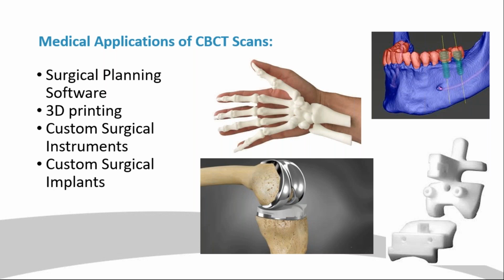And last but not least, the picture here of the knee replacement. We're hoping, and this is future applications, but we're working towards this now, is looking at actually being able to template for custom surgical implants and having that happen. We're currently doing that at Curvebeam in ankle replacement, but just steps that we're continuing to take further and further in the cone beam CT realm.